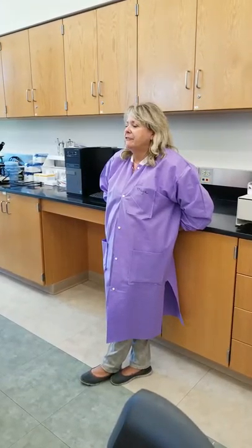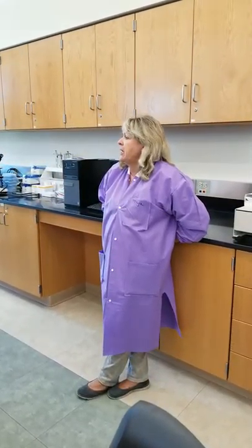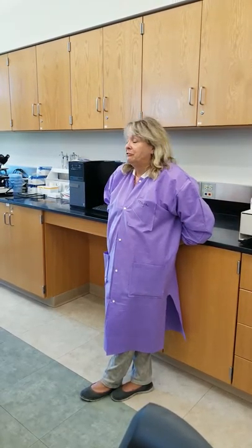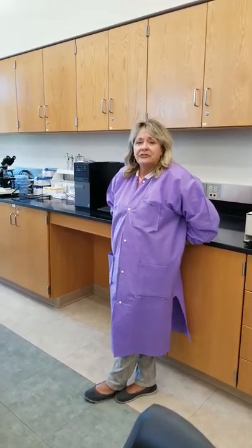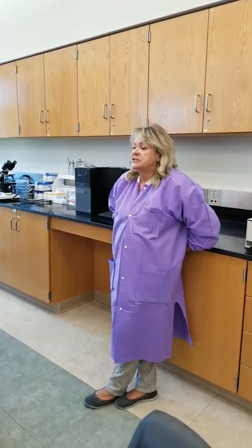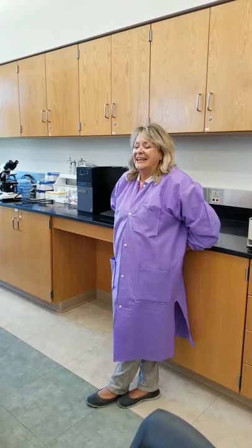You're very rarely ever going to get away from tubes, so no matter what methodology you might possibly use in your blood bank, there will be tubes around and you will have a necessity to use them on occasion. We have instrumentation in blood bank. Most of the time the instrumentation is just application of either the MTS gel system or agglutination or solid phase.